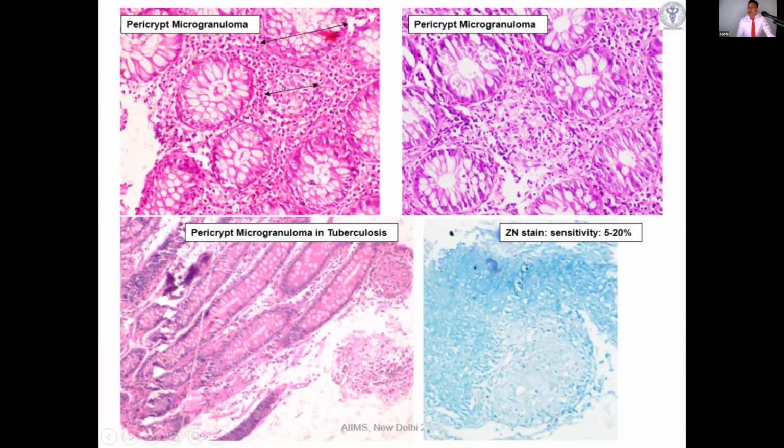In Crohn's disease, all of you know, in up to 20-30% cases, we can see some granulomas, but in Crohn's, granulomas are usually smaller, seen in the mucosa, just next to an intact crypt. We call them non-cryptolytic granulomas. And these granulomas, unlike tubercular granulomas, are ill-defined. They're formed by epithelioid or normal histiocytes and inflammatory cells, but less circumscribed. Okay. So these are pericryptal microgranulomas. Microgranulomas can also be seen in tuberculosis, but they are usually relatively well defined.